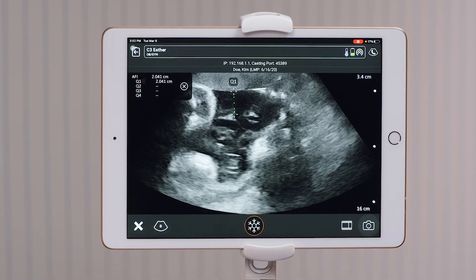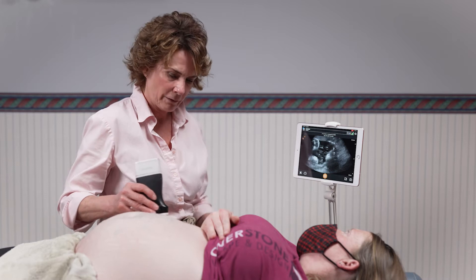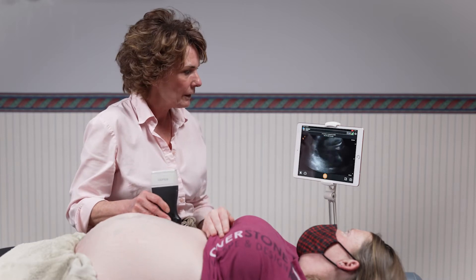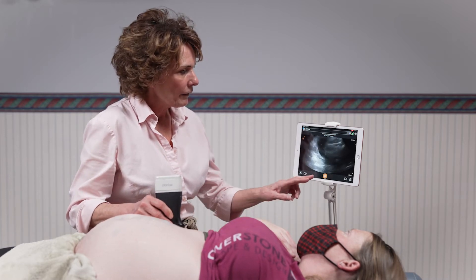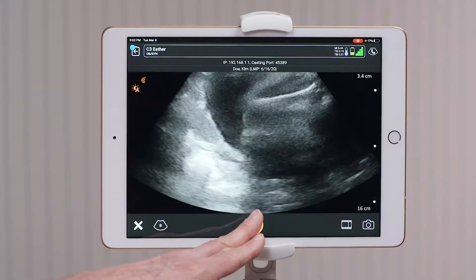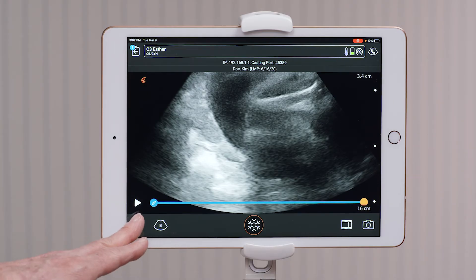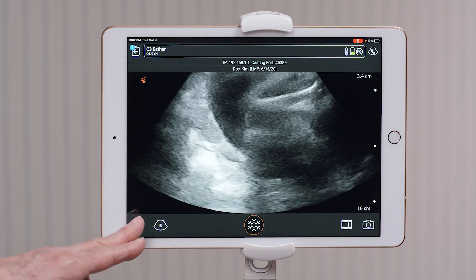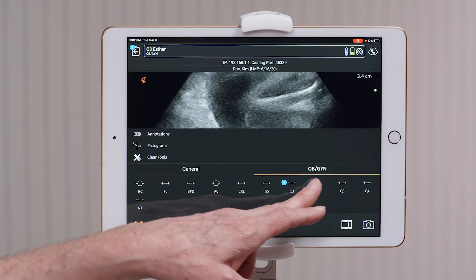Move up to the right upper quadrant, freeze the image, and again select my measurement tools on the bottom left and go to quadrant two.